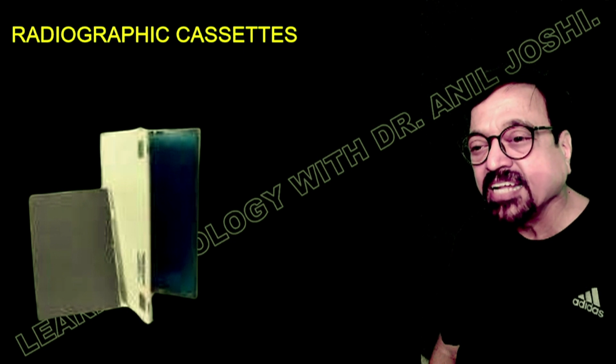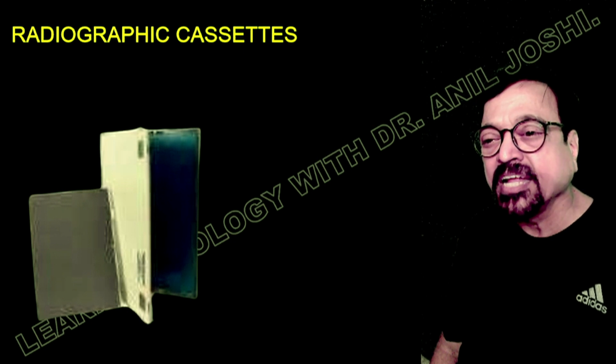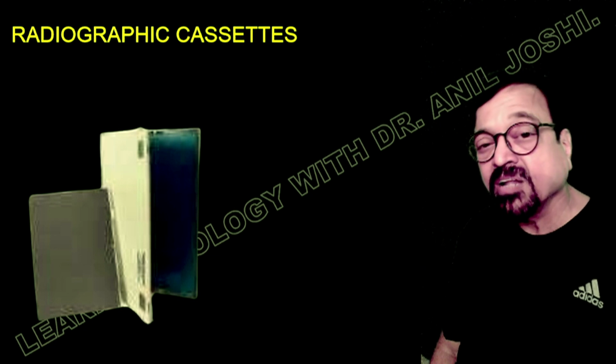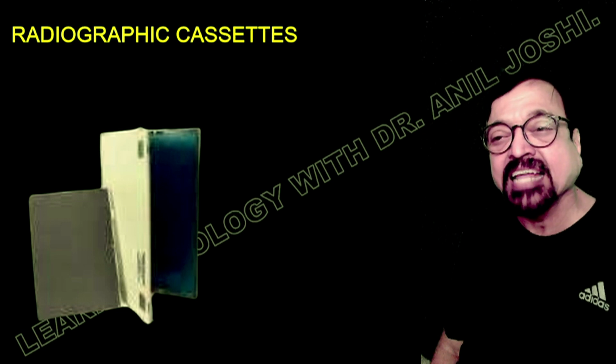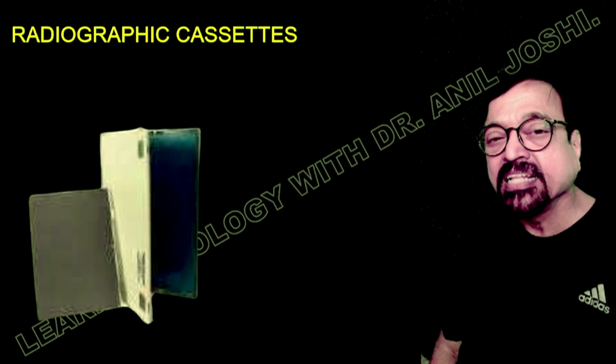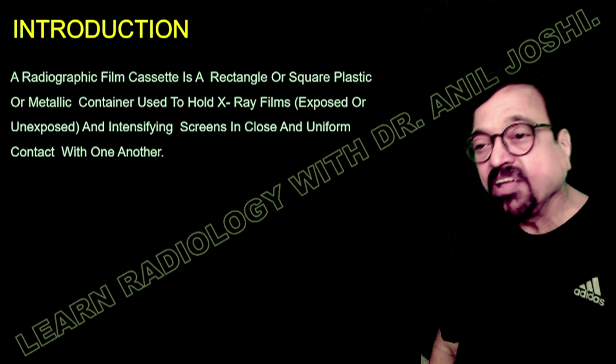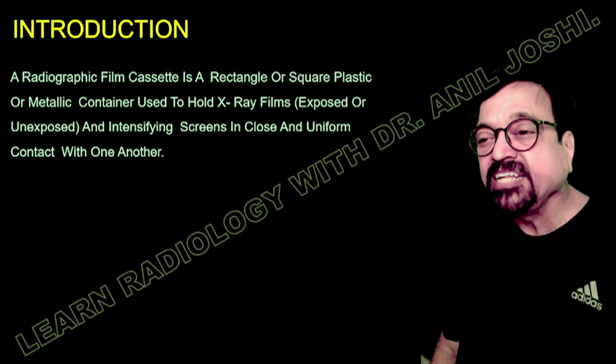This is a cassette which looks very simple. It has got two openings. One is called the front, another is called the back. Inside are the screens which are fixed, not like CR where the screens can be removed. This screen cannot be removed. The front screen and the back screen are totally different. They're not the same.